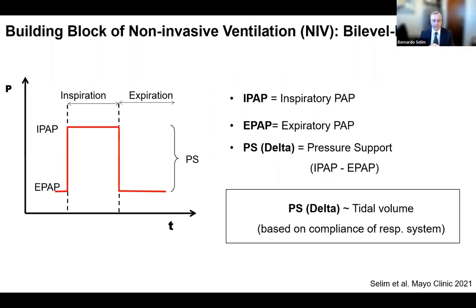I want to pause here to tell you why I bring this very basic concept that you probably know by heart. For different reasons, you have already seen this. Sometimes when you are jumping from one device to another, let's say you're doing sleep medicine inpatient and sleep medicine outpatient, and you have a device that they have used in the hospital and a device that they are using in the outpatient setting, you may see that even in the same brands, the settings may refer to an IPAP or the settings may refer to pressure support.